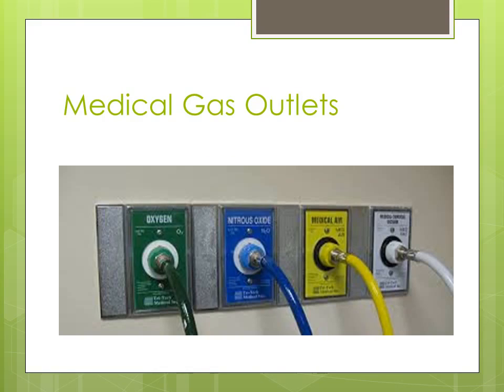Here's a classic oxygen outlet, or medical gas outlets, pretty typical. There are different styles of outlets. One thing to keep in mind about outlets, and this is something I ran into with one of my facilities, is as we had different revisions of buildings added onto each other, we had a situation where we lost standardization of outlets, and we ended up with several styles of outlets.